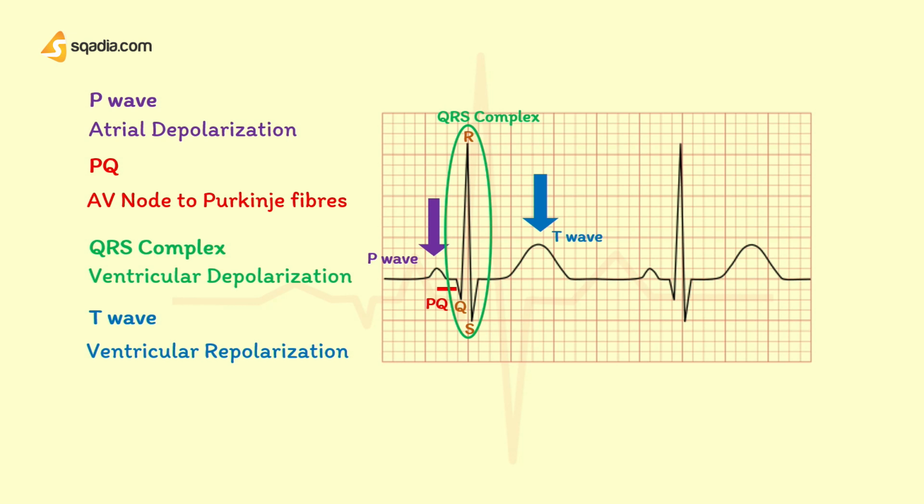Something seems amiss, right? Yep. It's the repolarization of the atriums, which is actually occurring at the same time as the QRS complex. And since the ventricular depolarization is such a large deflection, the atrial repolarization is embedded within the complex and does not show separately on an ECG. So that concludes our basic features of a typical ECG.